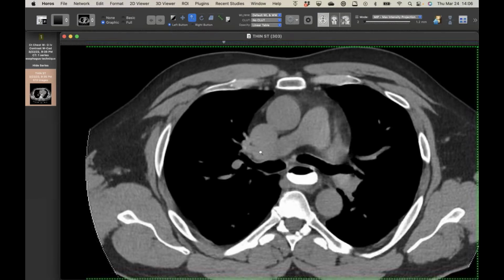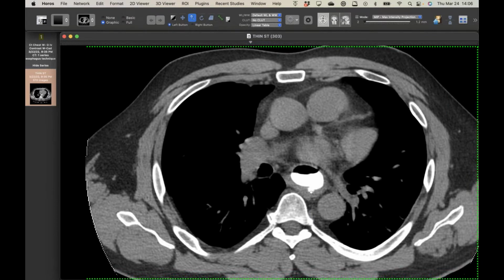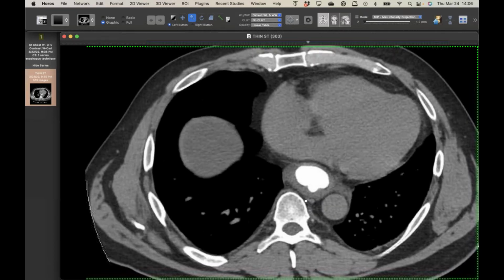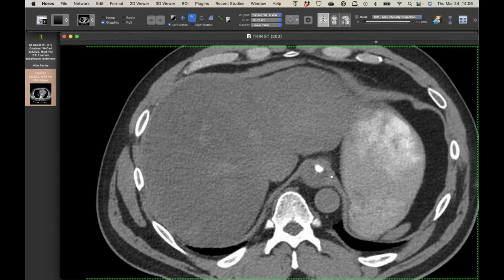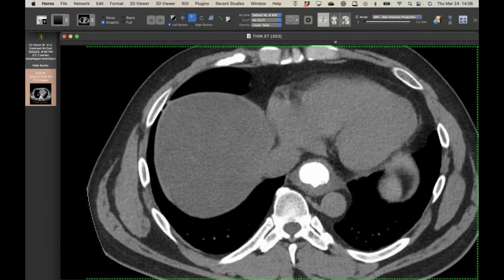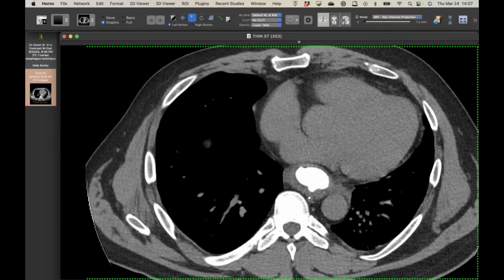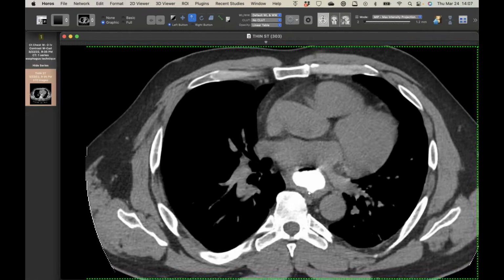This one turned out quite well. You can see there's a nice column of contrast. Then you can see a nice little mural defect here, not all the way through, but a mucosal defect at least at two levels here. And then you can see the diffuse thickening of the esophageal wall, and a tight junction down here. I've made MIPs of these before to reproduce the esophagram effect, but it's just a nice case of an incomplete thickness longitudinal tear of the esophagus in the setting of eosinophilic esophagitis.